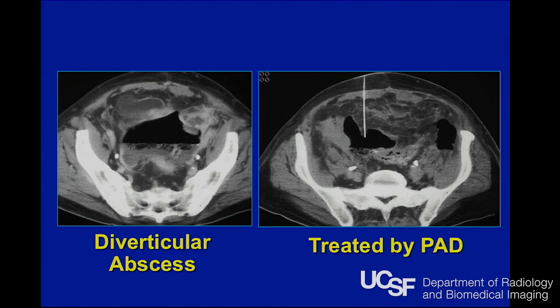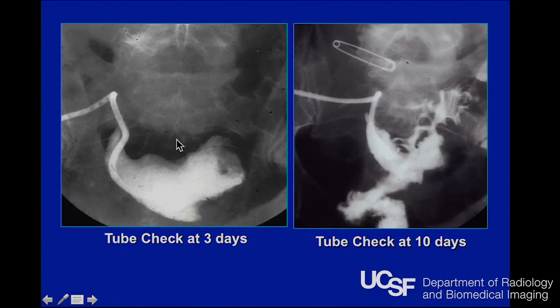All right. This looks like a slam dunk abscess, no problem. Easy approach. Nothing in between, going transverse. So this is an abscess that contains air and fluid, diverticular. One thing you might be worried about is that there's going to be communication with the colon, especially with this appearance, and that's indeed what you see.